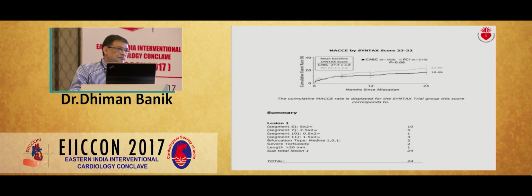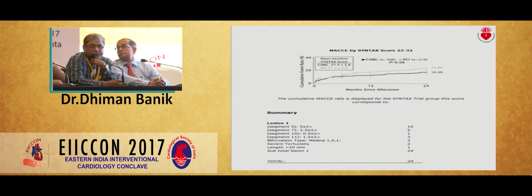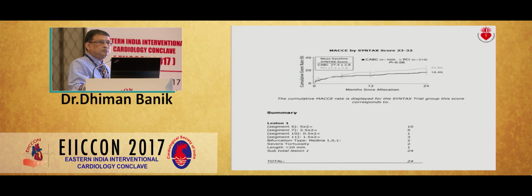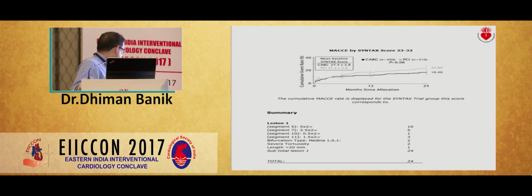Yes, Alok, what's your comment about the angiography part? In the LAD, the mid-segment lesion doesn't appear, at least on angiogram, to be very severe. I think an FFR should be done for that lesion. As regards the circumflex, it's obvious it's around 90%. That would be my strategy.